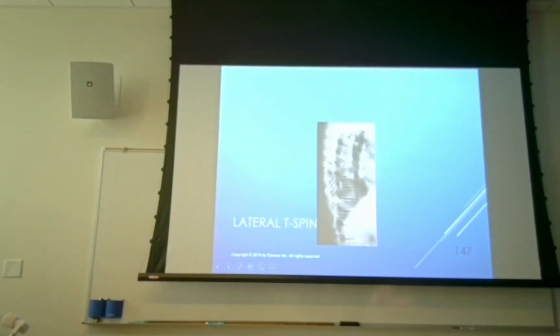On a T-spine, we're going to be looking at the intervertebral foramina on the lateral, which means we're going to see the zygapophyseal joint on the oblique, right? So the oblique, since it's not in here, I want to direct you to page 468. The obliques on a T-spine are the steepest obliques that I think we've talked about yet. I think Gracie came pretty close, but that was about it.